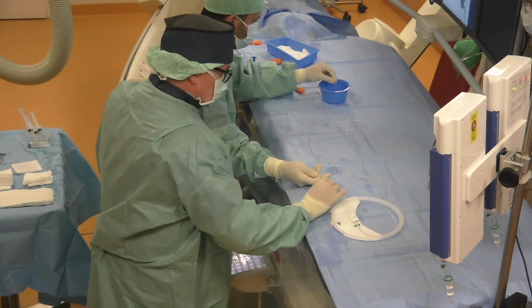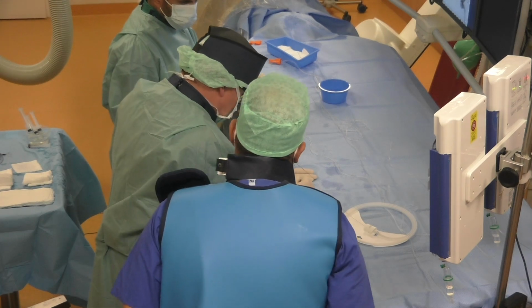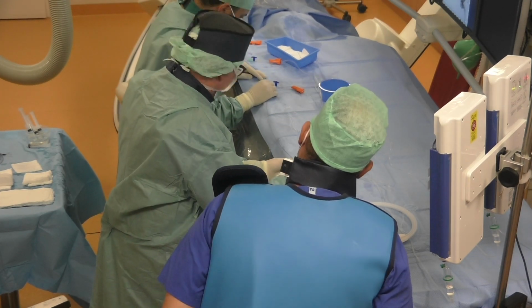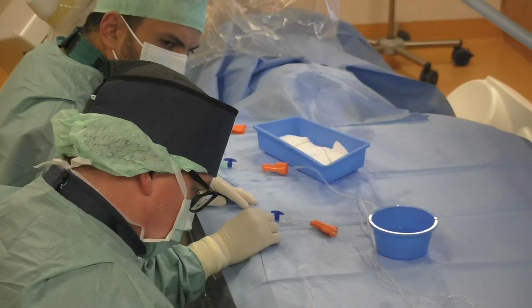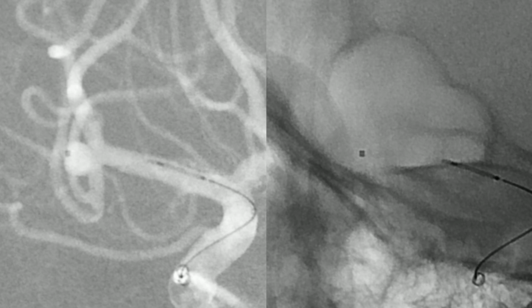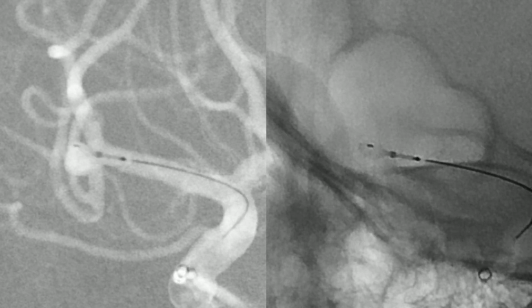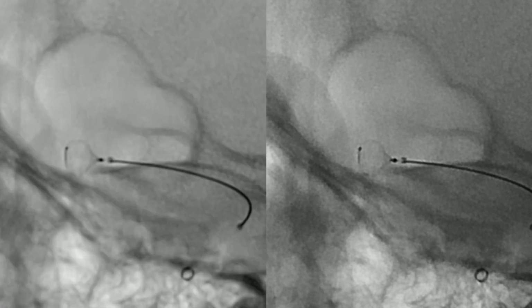We flush it with saline by exposing it in saline 2 to 3 times, and then put it in the hub of the microcatheter, flush it with saline, and now we can push it into the microcatheter. And now we are ready for the implantation. We push the Artisse device into the sac of the aneurysm and pull back the microcatheter, and now the device is in the sac of the aneurysm.